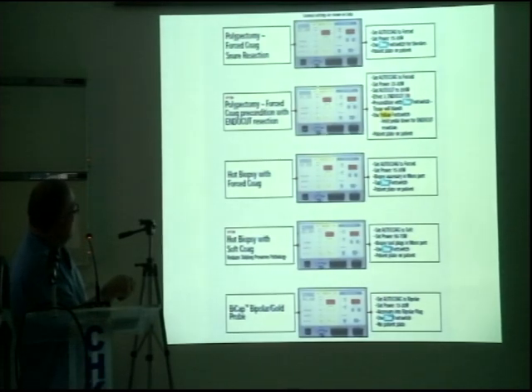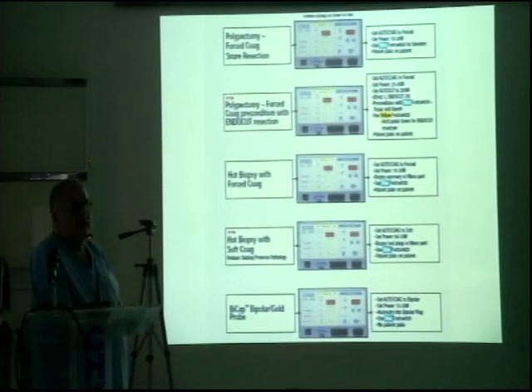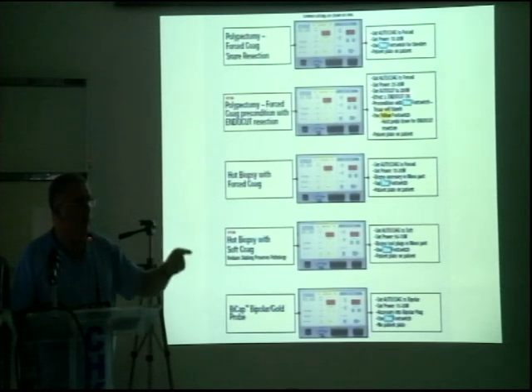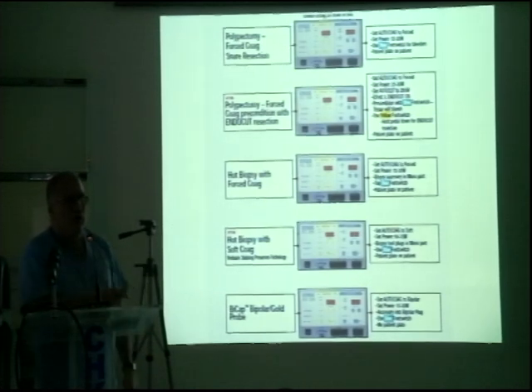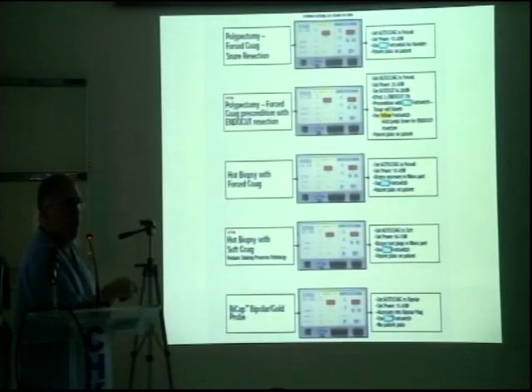On this system, you've also got what is called effect. Now, effect is actually talking about how dense that current is. So should you have effect 1, you will have a number of these waves. If you have effect 4, they are longer and there are fewer waves, fewer cycles. So you actually deliver a greater area of coagulation in effect 4. So if you're going to use it, you'd use effect 4 in the rectum. You would not use that by any stretch of the imagination in the cecum, because you'd end up causing necrosis and perforation.